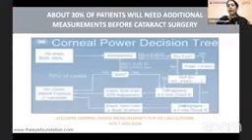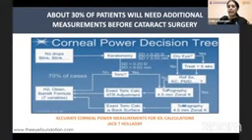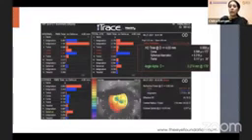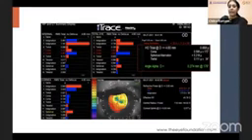There are certain unusual measurements in unusual eyes. Around 70% of eyes, you're fine with your average formulas. But sometimes you would see a dry eye status which needs to be addressed. Some of these patients need tomography, you need to understand the posterior corneal astigmatism, whether there's an irregular astigmatism, and whether you need to use specific formulae. In a post-LASIK eye, you need to look at the higher order aberrations which are induced in these eyes. Would these patients do well?